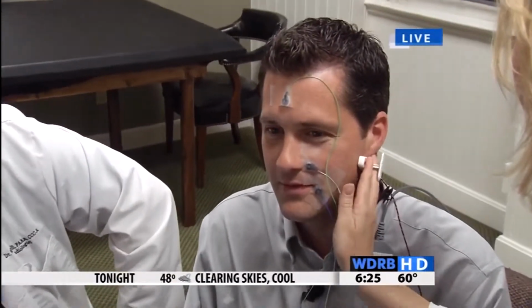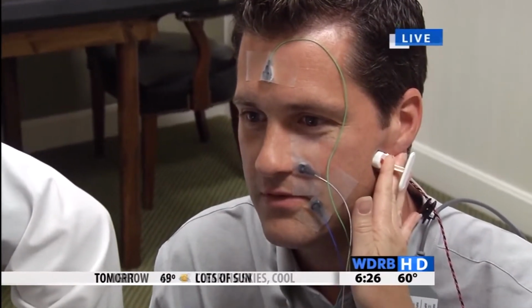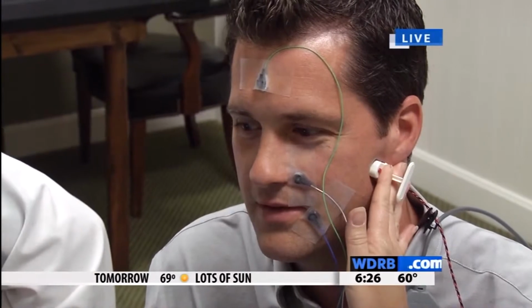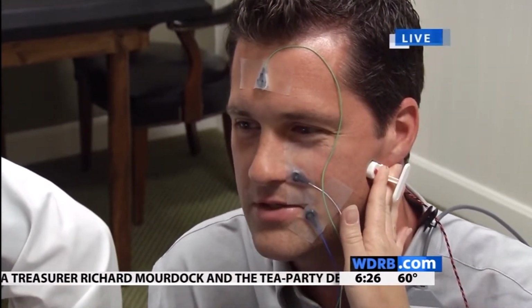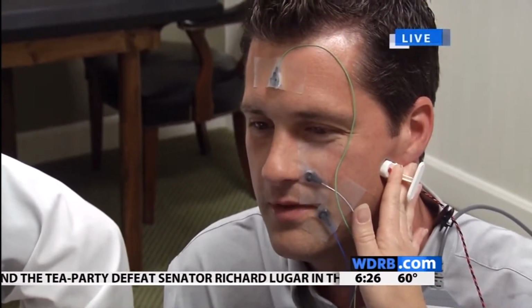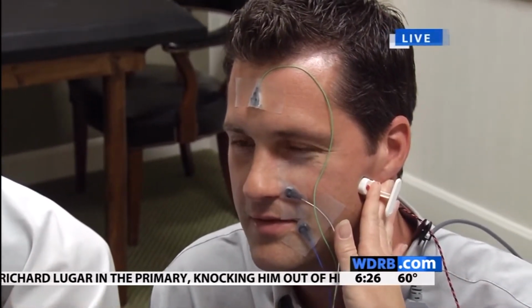Okay, Dr. Mary Burton, come on in and let's start with our electrical impulse here. Okay, a little nervous. Go ahead there. And my face is going to jump a little bit, maybe? A little. Okay, go ahead. Let's see what we got. So this is just on 30, right? It goes up to 40. So the highest is 40. And so what did we learn from that? My face is jumping, right? It is jumping. Okay, yep, that's good. My eye twitch.